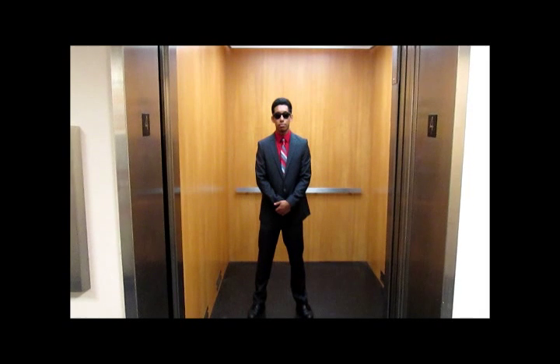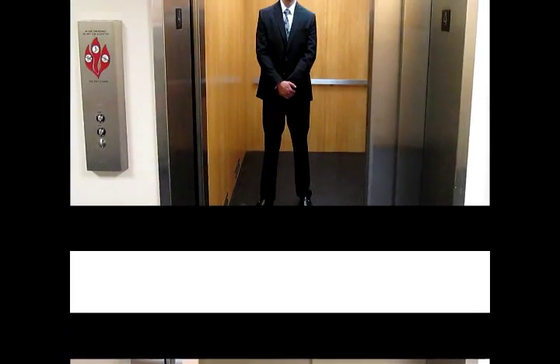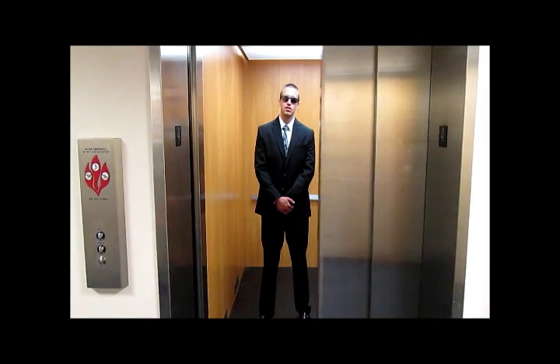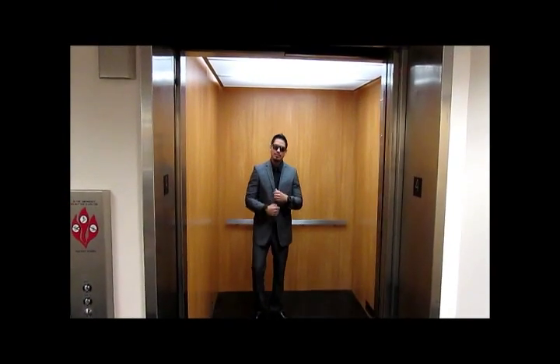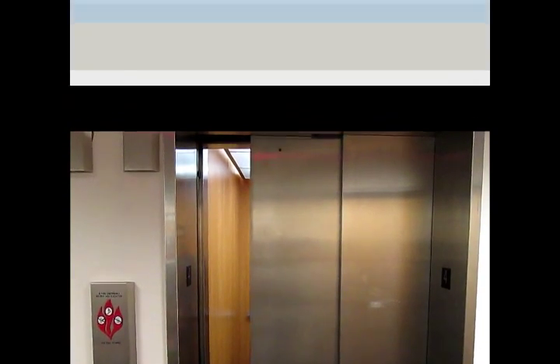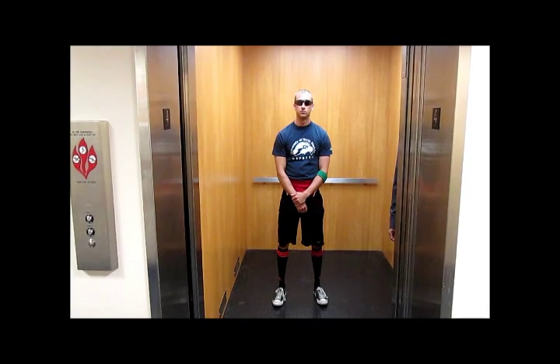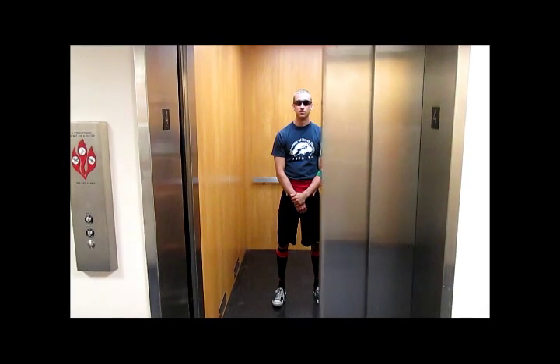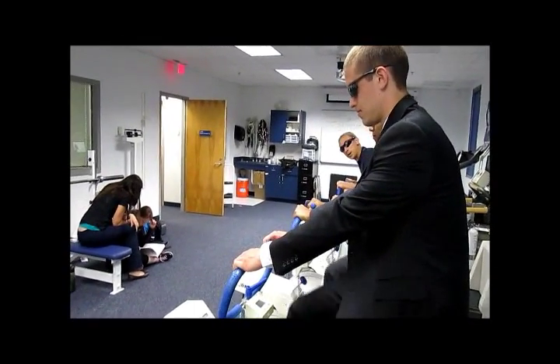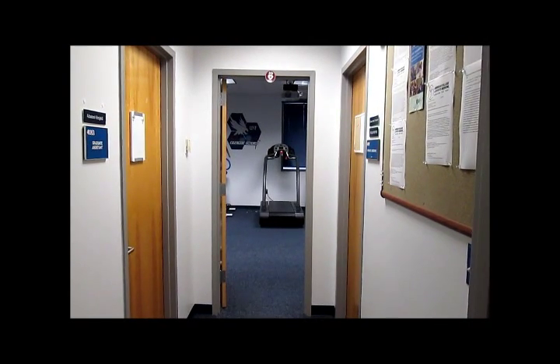Jeff Espinoza, Cass LeBlanc, Johnny Castro, and Austin Como. Today we are doing the YMCA Bike Test, talking about the equipment we are going to use with the YMCA Bike Test.